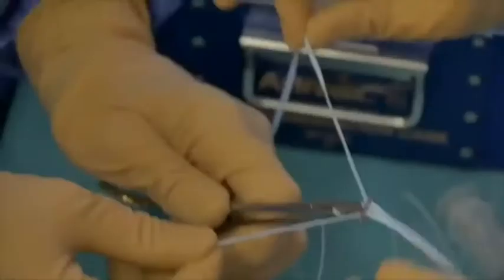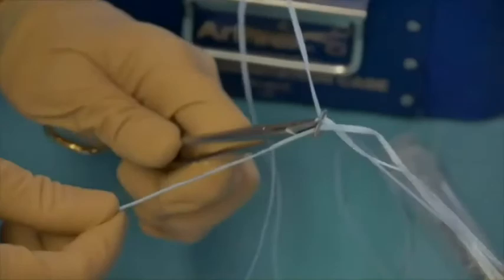Next, a tightrope cortical button is prepared by removing the white tightrope part and replacing it with a fiber tape.